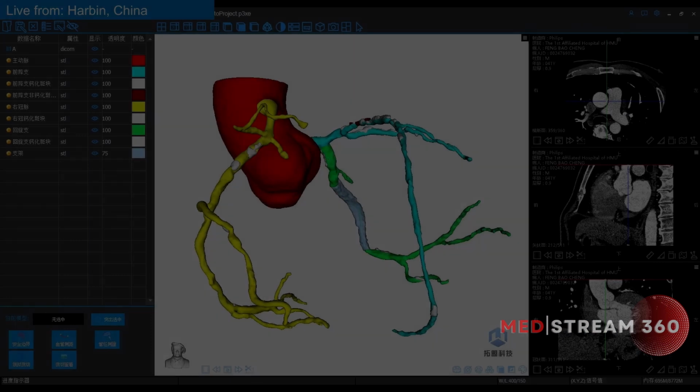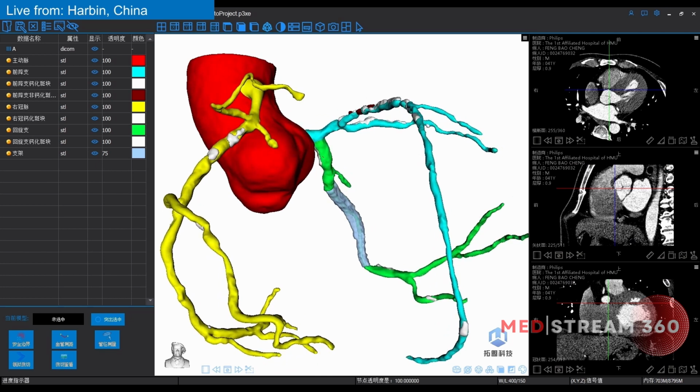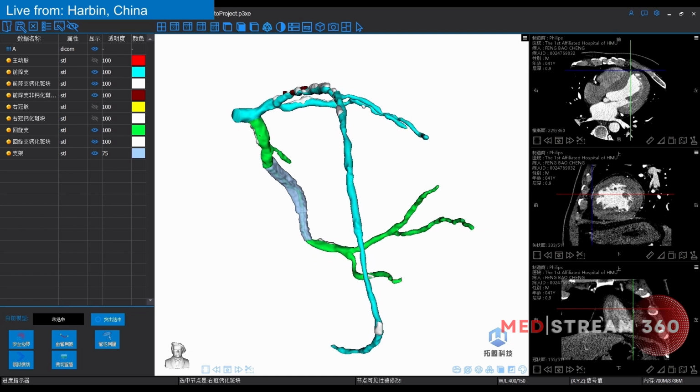Like we could see in today's angio, the patient has an anomalous RCA ostium. And this time we also used our AI visualization system to reconstruct the patient's CTA. But very interesting, as we know, CTA accuracy sometimes couldn't be 100%. So the CTA told us the LAD is patent, but this is the reconstruction of the CTA imaging. We already did the angiogram, and the LAD is still occluded.